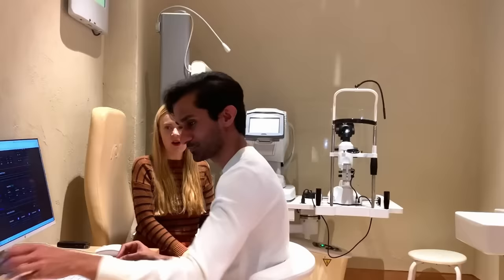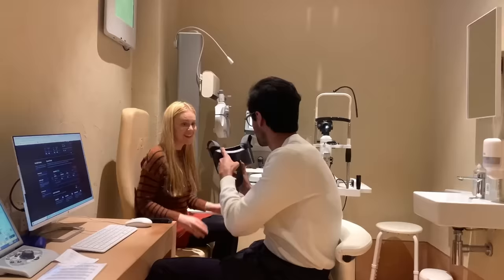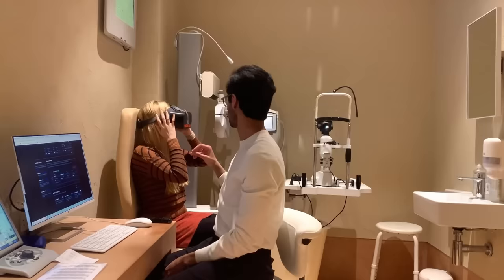Cool. One more thing. Okay. So I think we've tested your central vision. Just one thing that we can test is your peripheral vision. It may be a bit different to even before. If you just want to put that on for me, please. Okay, thank you. No worries. I'll put it if you need. Is that feeling comfortable? Should I tighten it a little? Yeah, no, it's all right.